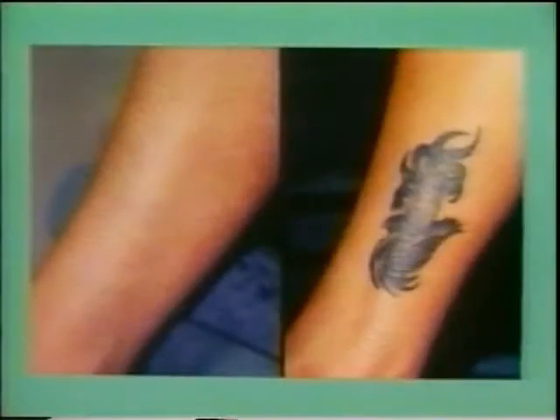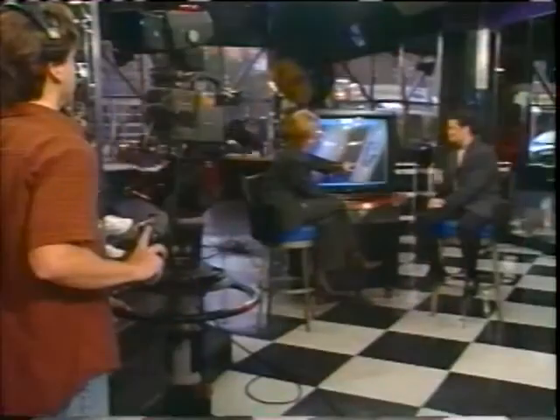Show me another picture of it before. A little more difficult. You have a yellow and orange beak with some variegated color inside this elaborate bird. And we often need to use 2 or 3 laser systems to attack each of those colors. But you can get nice results. Again, you can still see a green hue on the after. So about 10%, just a little bit, remains.